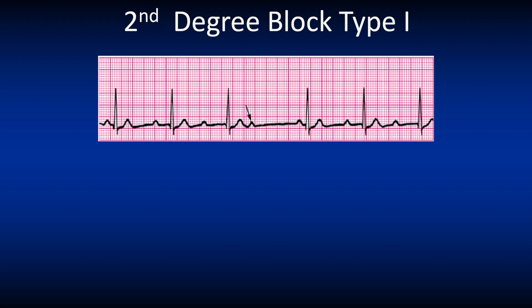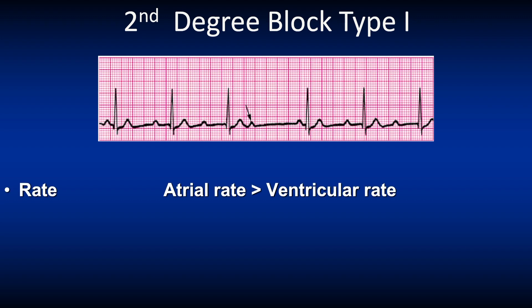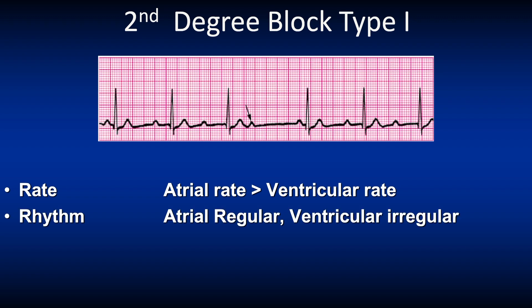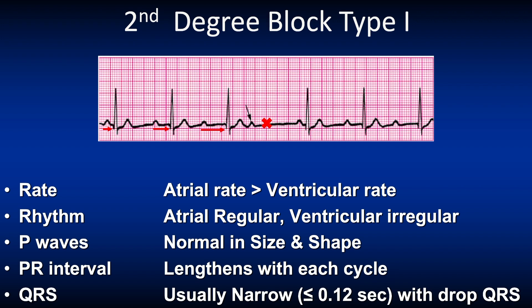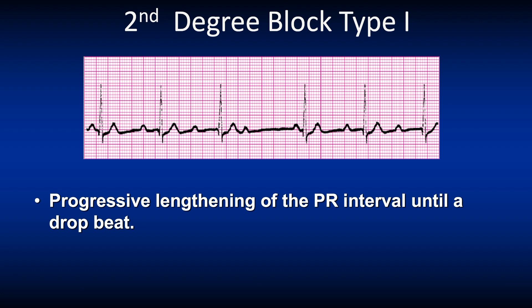Let's review the second degree block type 1. The atrial rate is more than the ventricular rate. The atrial rhythm is regular versus the ventricular rhythm, which is irregular, as there are dropped beats. The P waves are normal in size and shape. The PR interval lengthens with each cycle, although it may be a slight lengthening until a dropped beat. Look at the PR interval — it gets wider and wider, and there we see a P wave with the black arrow, and suddenly there is no QRS complex. The main concept to remember is that there is a progressive lengthening of the PR interval until you find a P wave that is not followed by a QRS complex.